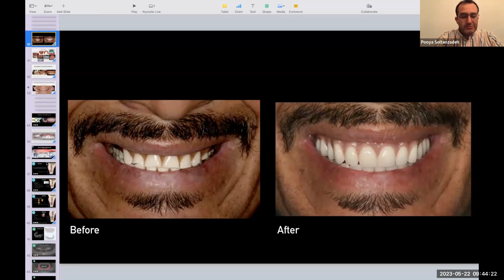Now, regarding the Facebow, if you don't have that, which is a new thing, and I don't expect people to have it much. I know it's kind of controversial, but a lot of research shows that for dentures, not using the Facebow is not a big deal. The biggest error that you may get would be the second cusp of the second molar. They set the teeth based on the normal averages, which I think are 10 degrees and 20 degrees for the joints. And regarding the occlusal plane, they go by the pictures and by some measurements.